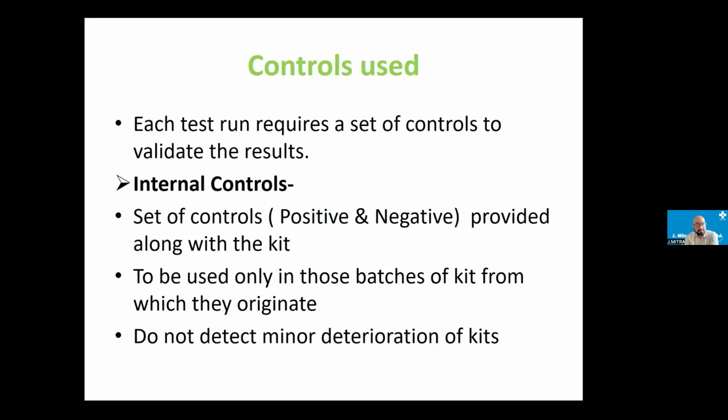So according to the NBTC or drug control regulations, we have to discard those samples. Frankly, we don't have the opportunity to analyze further. So that's the end point. If it is positive, we have to discard. We have the NAT facility available, but we can check it for academic purposes only. If it is CLIA positive, we have to discard.